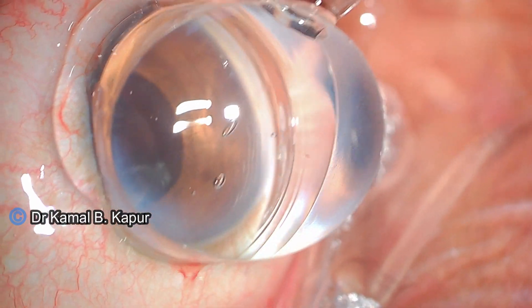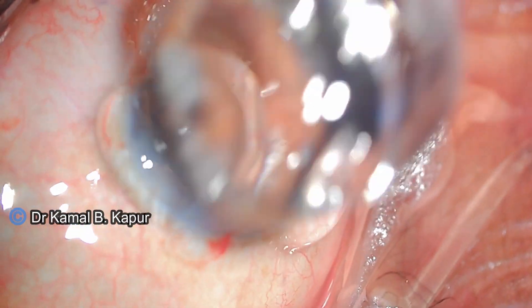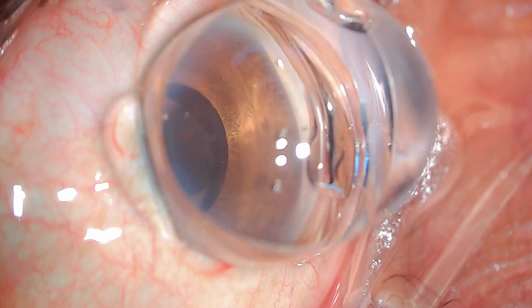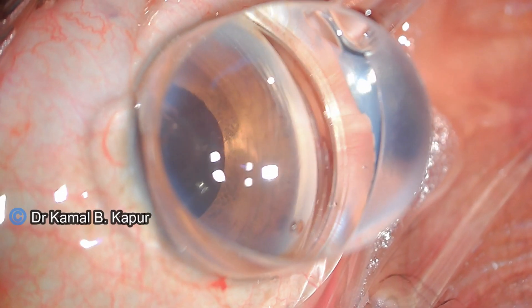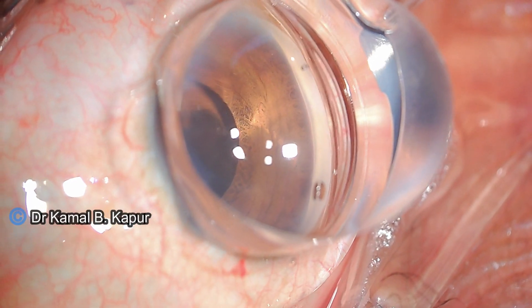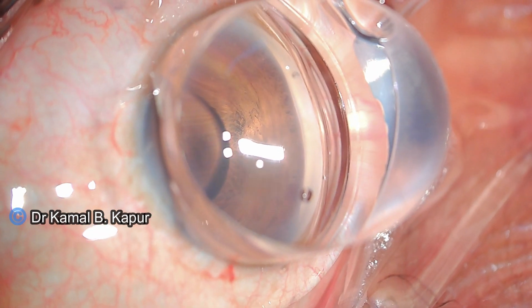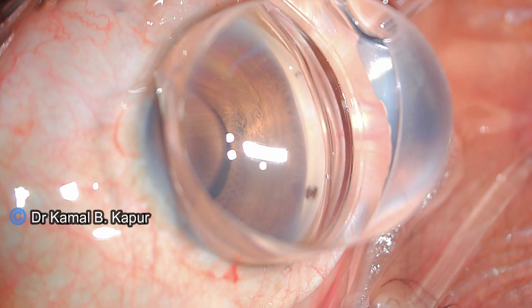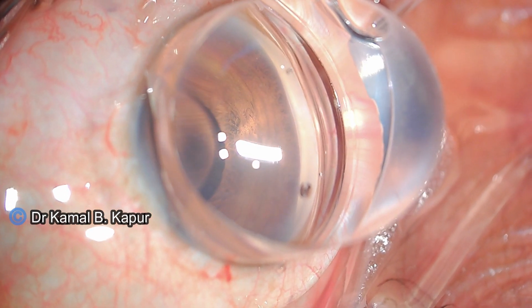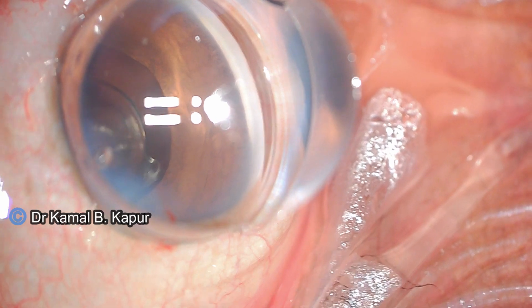Having done that, we place the gonio lens on top of the cornea. You will notice there are some air bubbles, so we relift the gonio lens and place it again on the cornea — this pushes the air bubbles away from the field of vision.